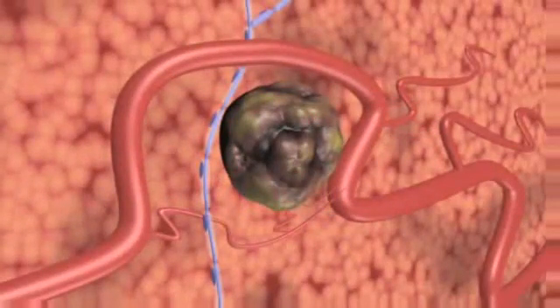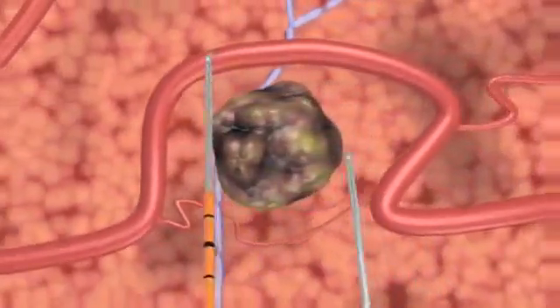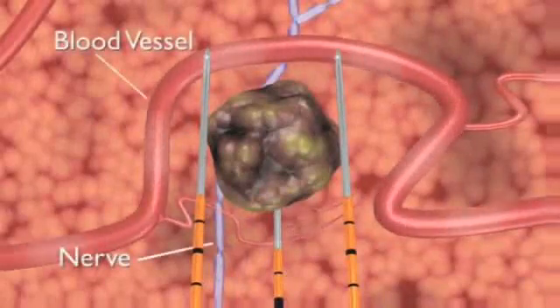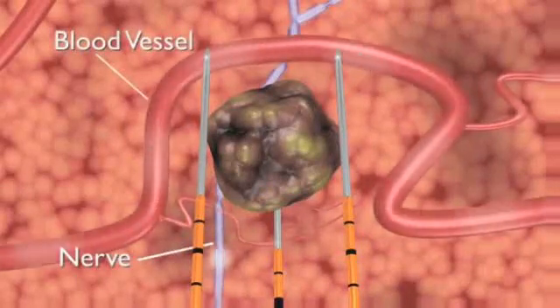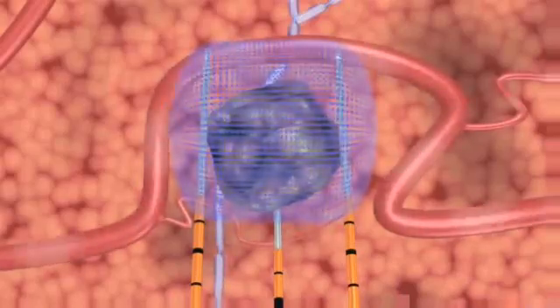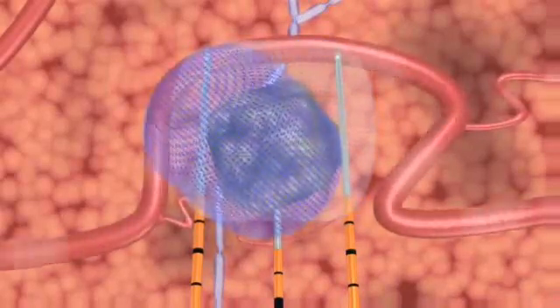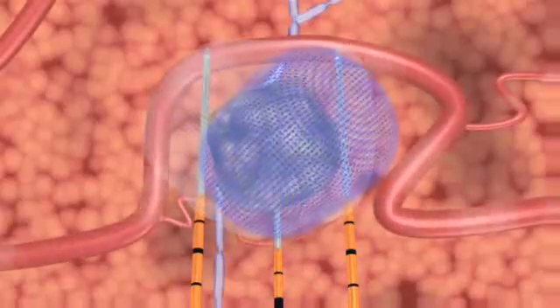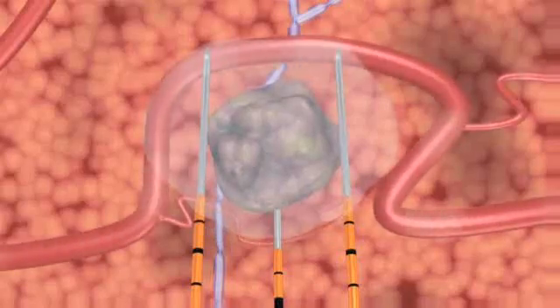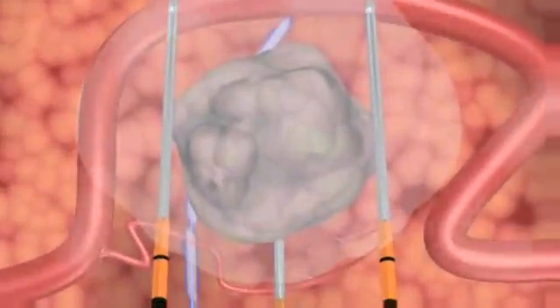NanoKnife IRE treatment induces cell death in soft tissue only. NanoKnife electrodes are placed in proximity to the targeted lesion, but unlike thermal ablation technologies, surrounding critical structures including nerves and blood vessels remain functional during treatment. After NanoKnife IRE treatment, cells that form the nerves, blood vessels, and other collagenous tissues in the treated area remain viable, reducing the risk of damage to these structures.